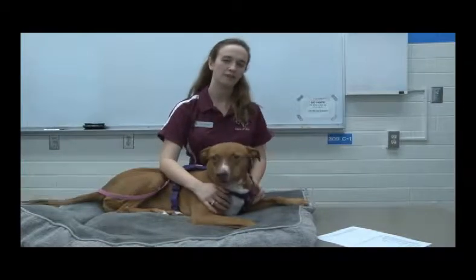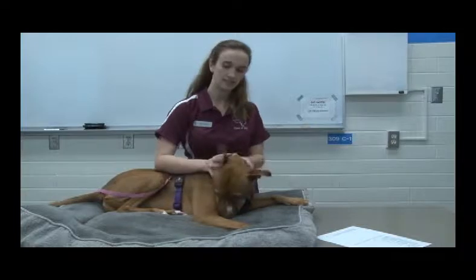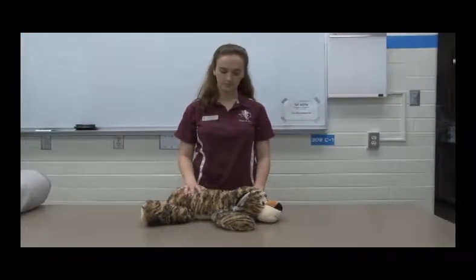I'm going to show you how to find the jugular vein for an injection or to draw blood. This is Kelty, she'll be helping me. The first thing you're going to do is prepare for the jugular vein. I'm going to demonstrate the proper restraint for a jugular stick with the stuffed animal.